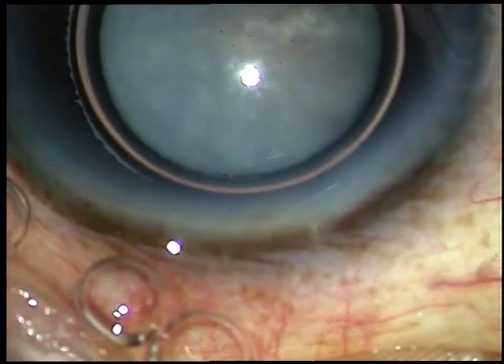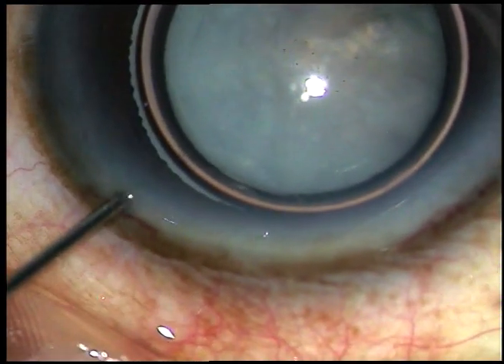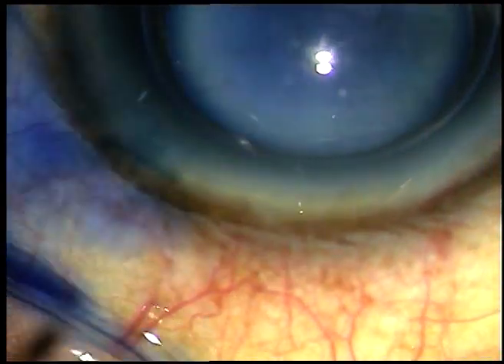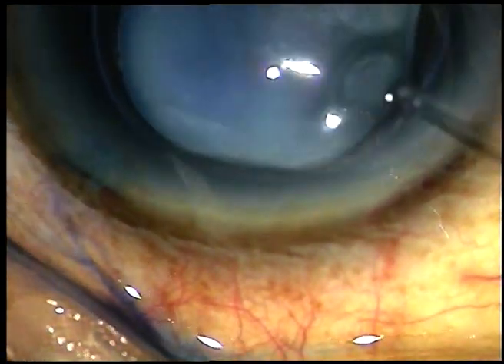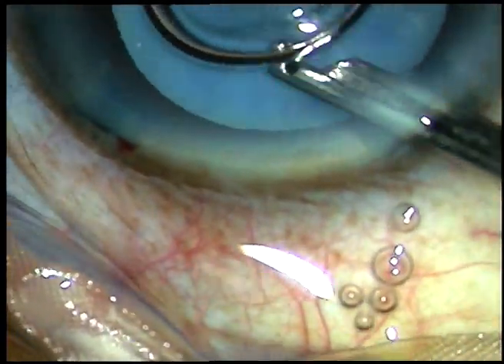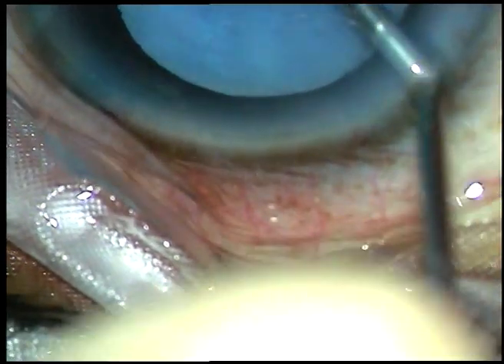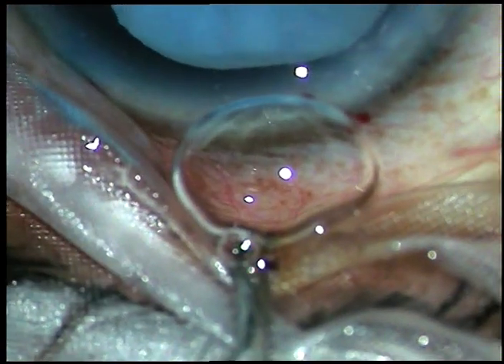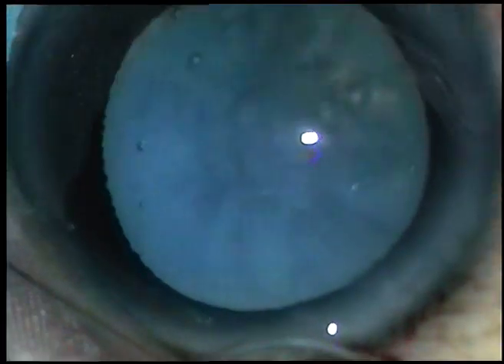This is an air bubble. I want to stain the anterior capsule with trypan blue dye underneath this air bubble. Here is the dye, and after 5-6 seconds the dye is washed out with a 23-gauge Simcoe cannula. The viscoelastic substance being used in this case is HPMC — that is, hydroxypropylmethylcellulose.